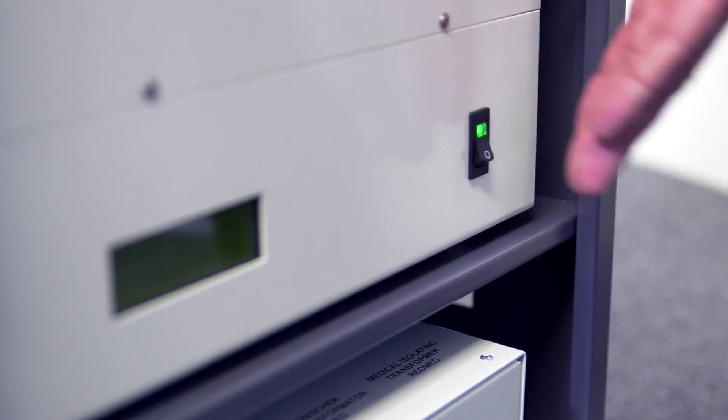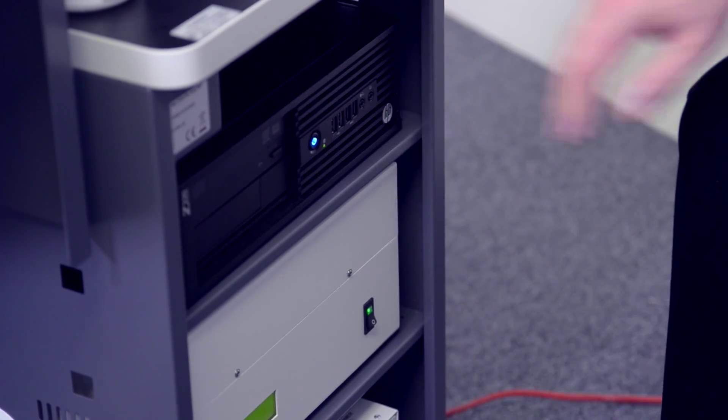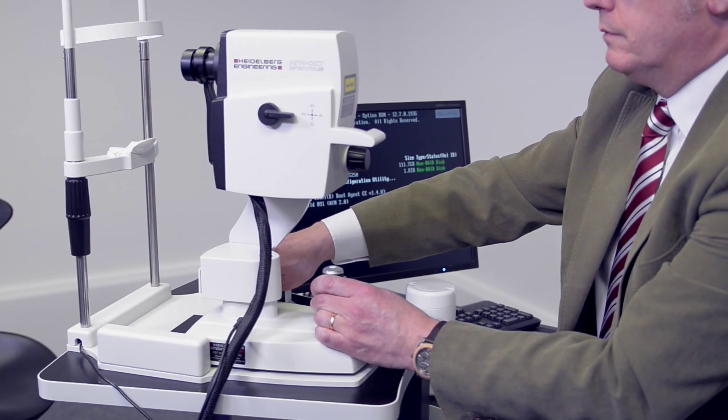HRA OCT Pre-Examination Best Practice. Switch on the isolation transformer, power supply and computer. Unlock the camera base and slide back to the full extent of its travel.